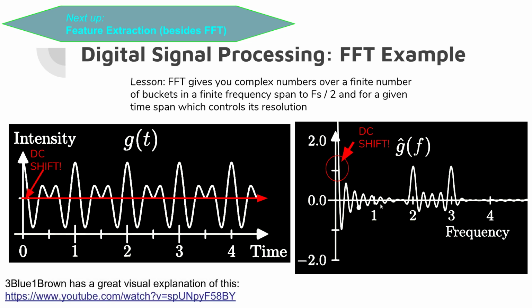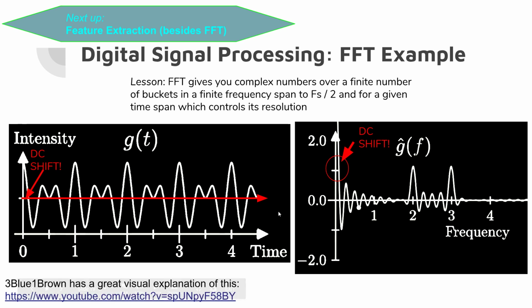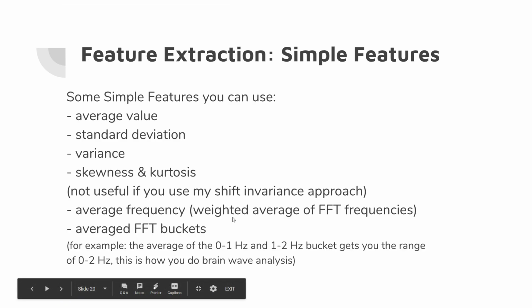to see some of these lower frequencies, you're going to want to do what's called mean shifting. So you take the average of the signal that you have been trying to take the fast Fourier transform of, and then you subtract the average from all of the data points, and you shift this down.